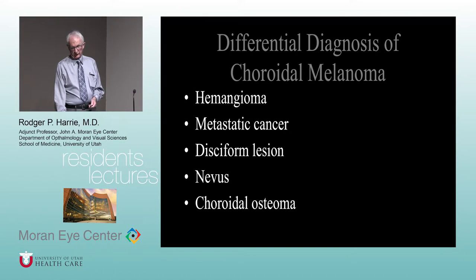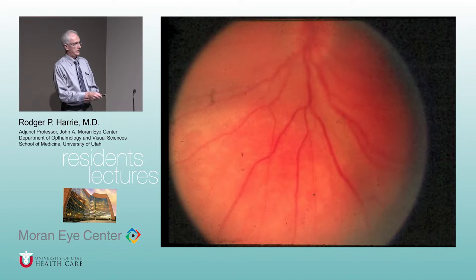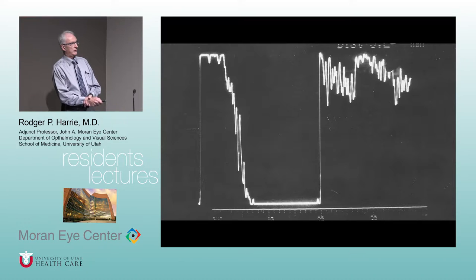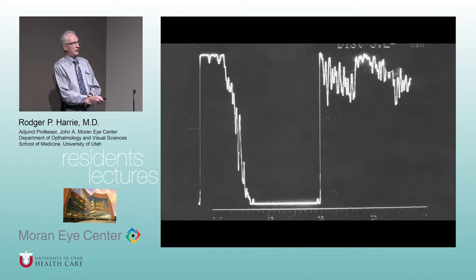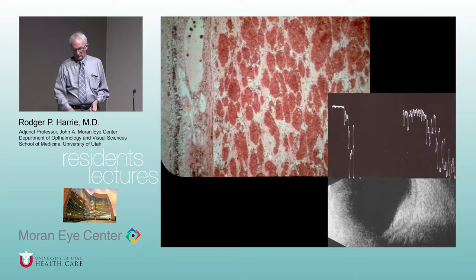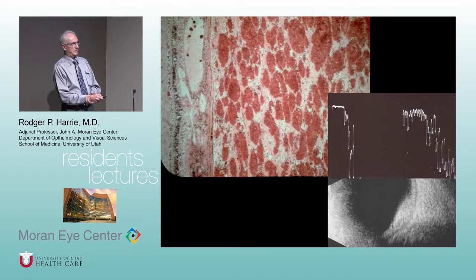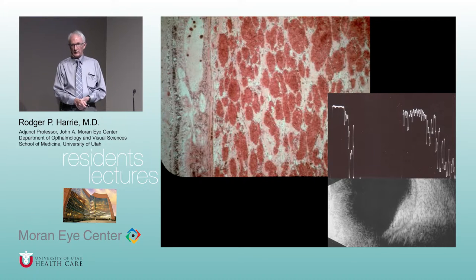Differential diagnosis. Here's an orangish lesion that could be melanoma or amelanotic. The A-scan is very helpful - going through the vitreous, here's the flat vitreous because it's homogeneous, then the surface of the tumor, the sclera, and the orbit. The actual tumor is very high-reflective - that's not melanoma; they don't get that high. And it has a regular up-and-down pattern consistent with pathology. The lesion is like a honeycomb - blood-filled spaces in a hemangioma. As sound goes through it, it hits a septum, goes up, hits a blood lake, goes down, septum up - that up-and-down motion is characteristic of hemangioma but not melanoma.